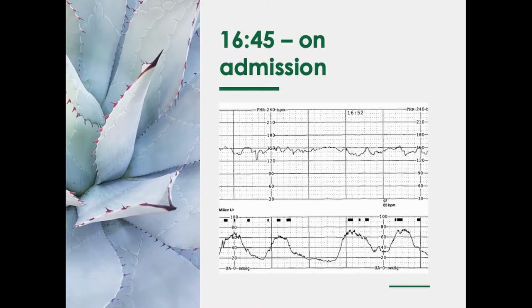This is where we should have really quick answers, everybody. Fetal heart rate baseline is defined over a 2-minute stretch of relatively consistent heart rate. It's the average heart rate, and it's rounded to 0 or 5. So you never say a fetal heart rate baseline is 143. That's a single point. It's 140, 145. You can round up, and it's an estimate over the most continuous flat portion of that tracing.